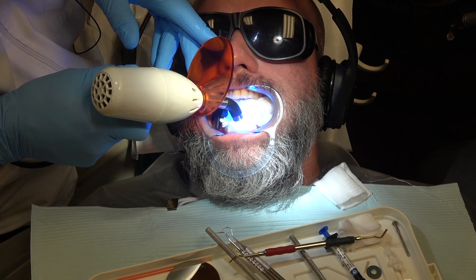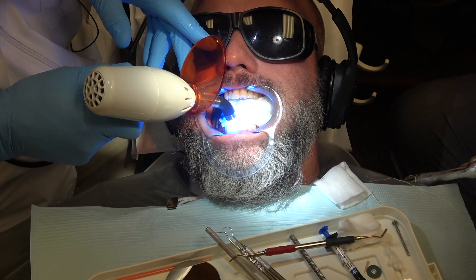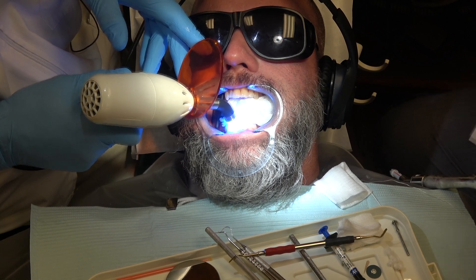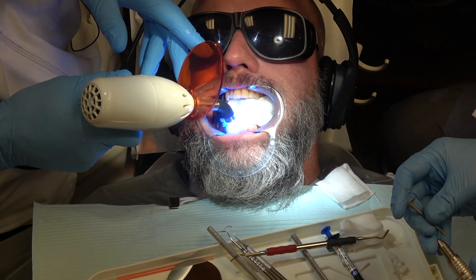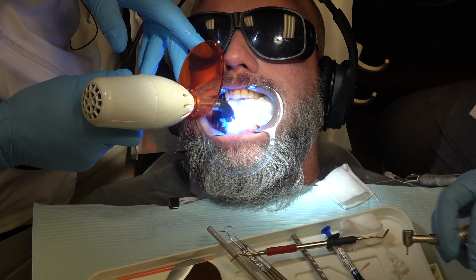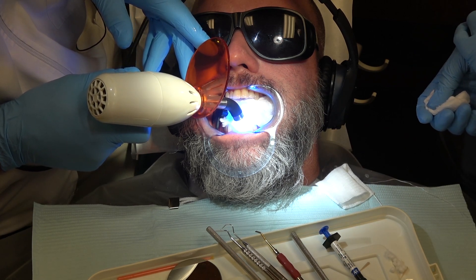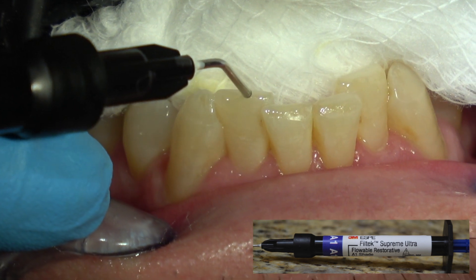Those lower central incisors are shorter than the lower lateral incisors — I can't increase the height of the centrals to the height of the laterals, or he'll break the composite off because that's not in his eccentric movement pathway, his glide plane. Now you can lengthen the teeth a bit with veneers, but the patient has to be very conscientious and be sure he wears the dental sleep apnea appliance or night guard every time he sleeps or takes a nap. We're just trying to get rid of the chipped, fractured incisal edges so it looks smooth and symmetric.